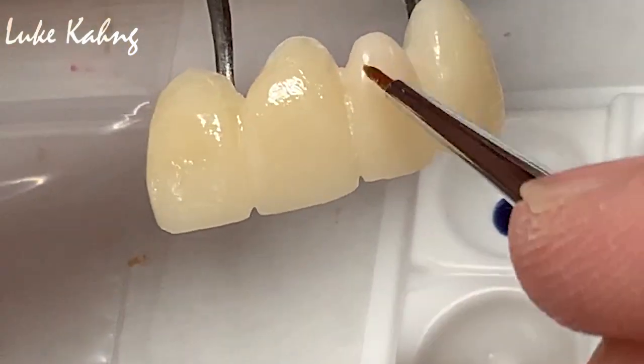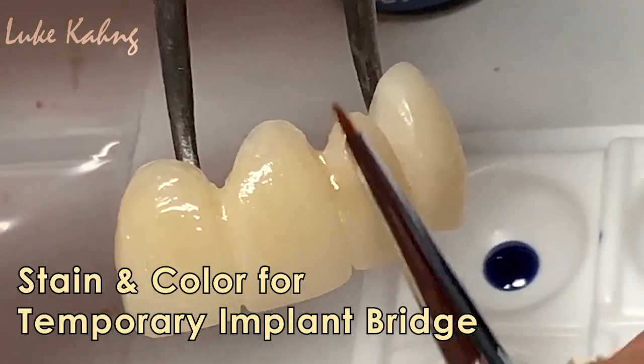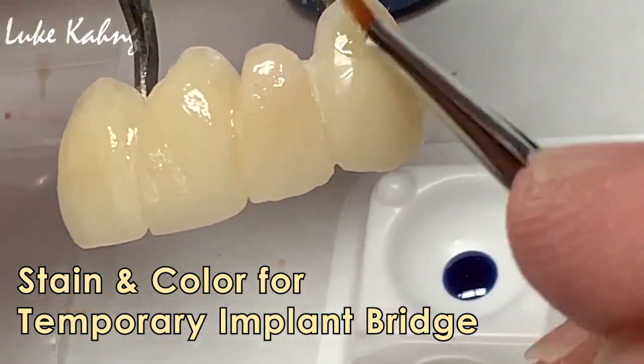Enough body, then subtle stain, just a little bit, not much. All right, that's good. K9.